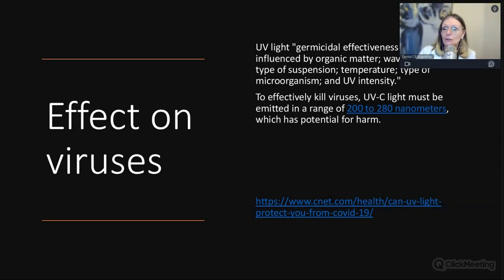What about UV light effect on viruses? And this is a study. UV light germicidal effectiveness and use, again, is influenced by what? Organic matter, wavelength, the type of suspension, the temperature, the type of microorganisms, and then UV intensity.